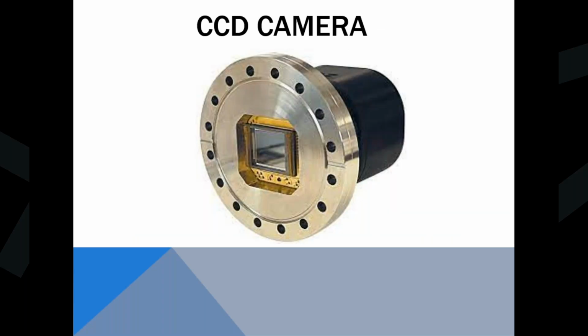And here's a CCD camera. So it is solid state, and I guess in a sense you could call it digital. Basically it has a grid inside. As the X-ray hits the grid, it charges the grid, and then it's able to develop the image based on the intensity of the X-ray hitting the grid inside of it.